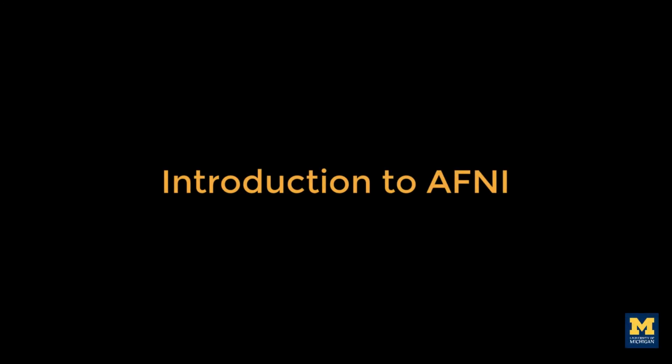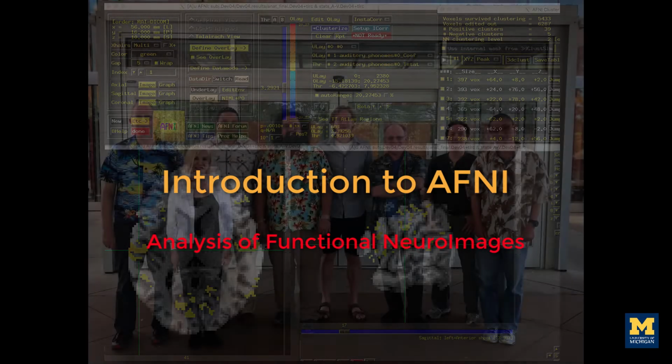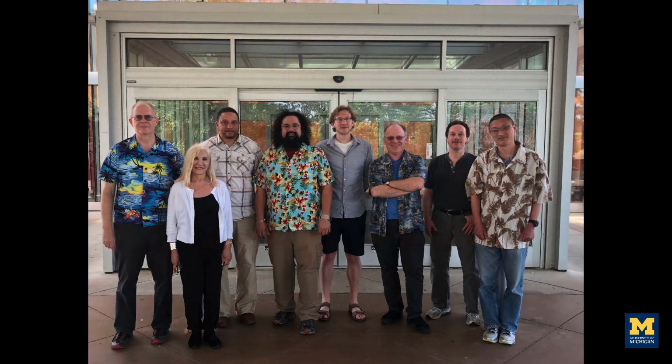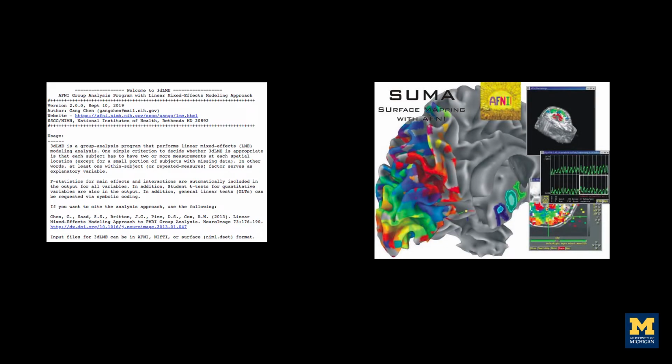Welcome to a new fMRI tutorial series on AFNI, the Analysis of Functional NeuroImages package. First created by Bob Cox back in the mid-1990s, AFNI has been maintained and developed by a team of scientists at the National Institutes of Health beginning in 2001. Since then, they've added several new features such as linear mixed effects models and surface-based analysis.